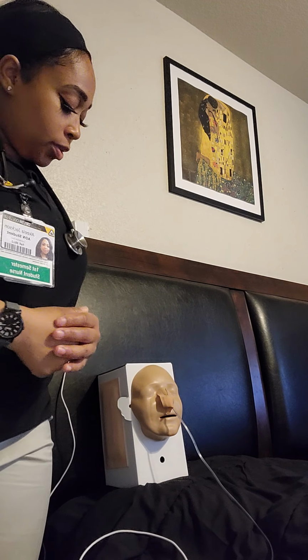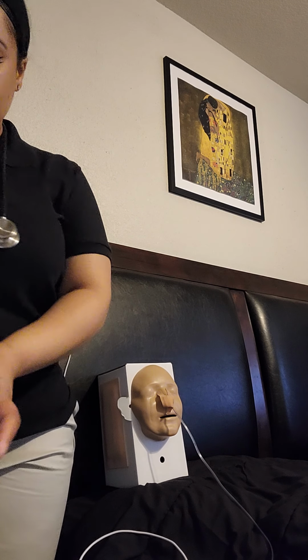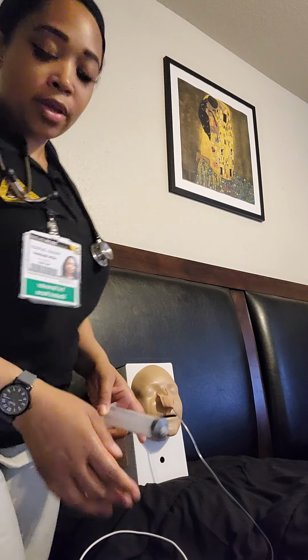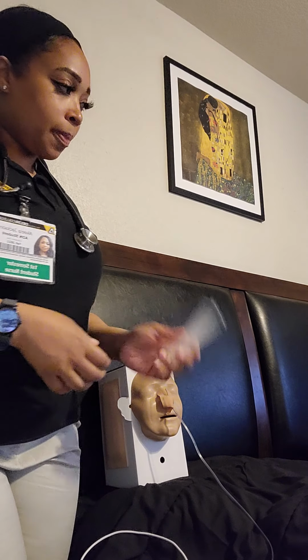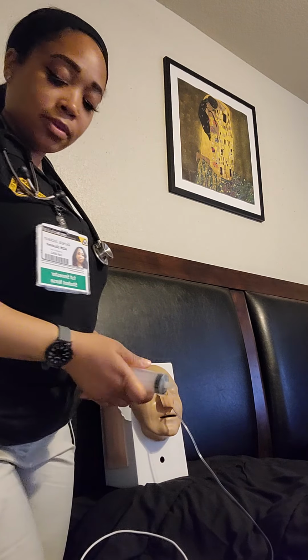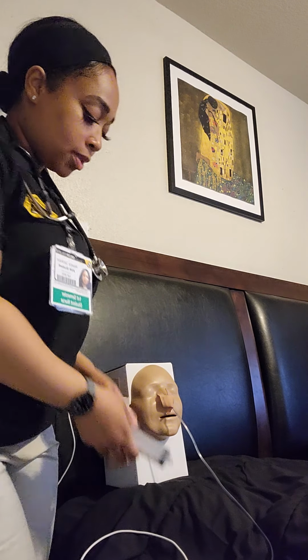So the first thing I'm going to do is get my piston syringe so I can check the residual. I have a graduated cylinder at the bedside so that way I can manually suction out any gastric content, and I will expel that content into the graduated cylinder.